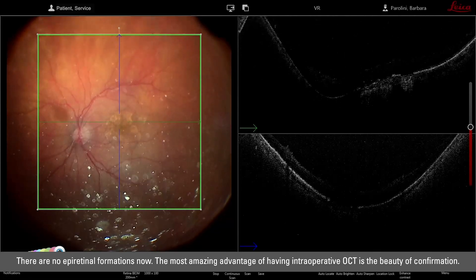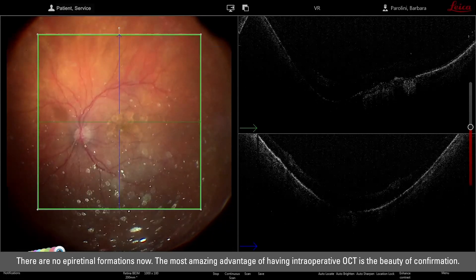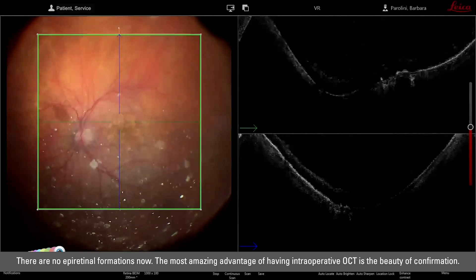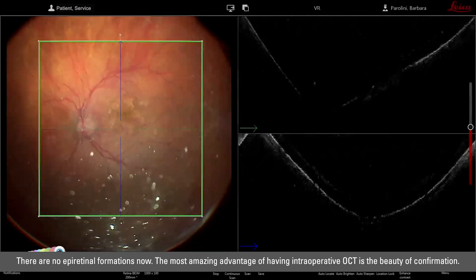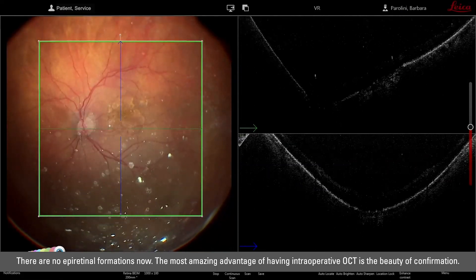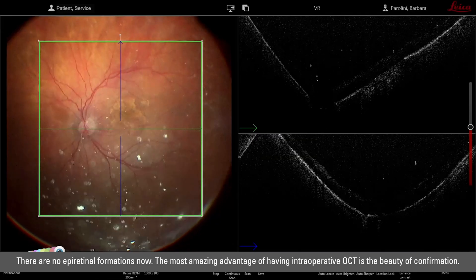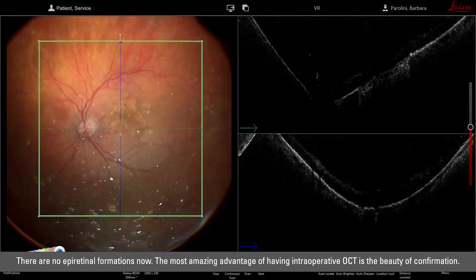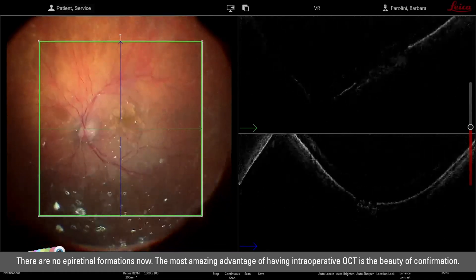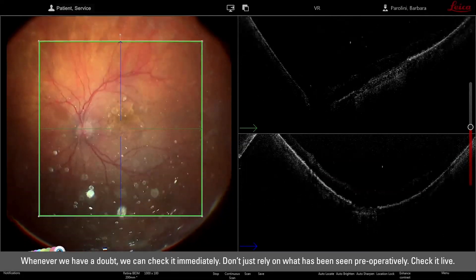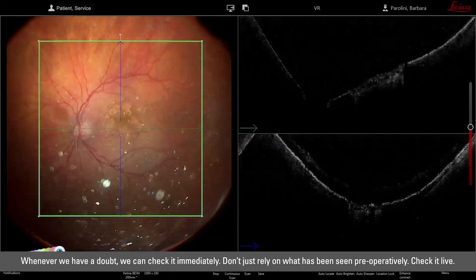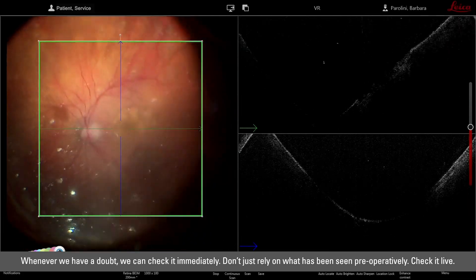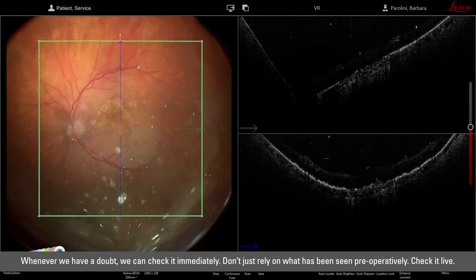I think there are no epiretinal formations now. The most amazing advantage of having intraoperative OCT is the beauty of confirmation — whenever we have a doubt we can check it immediately, not just relying on what we have seen preoperatively but checking live.